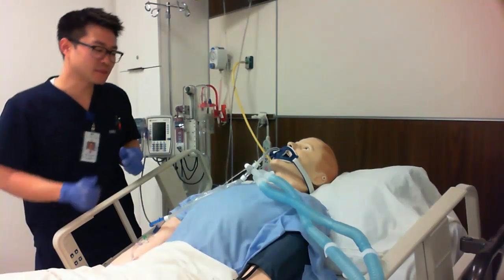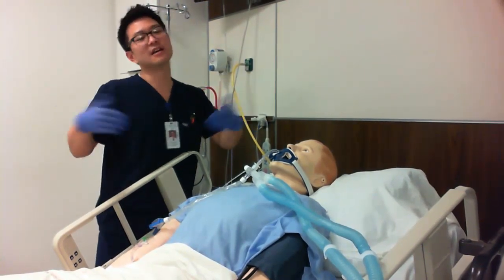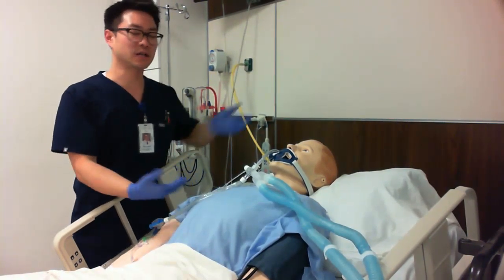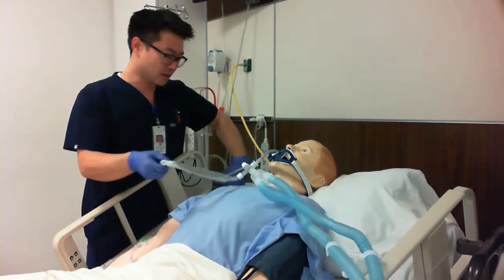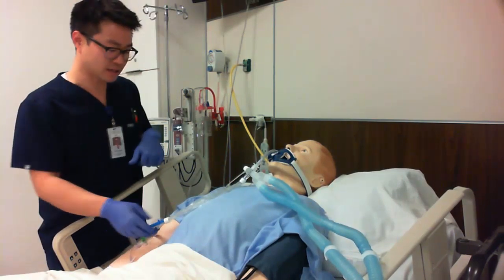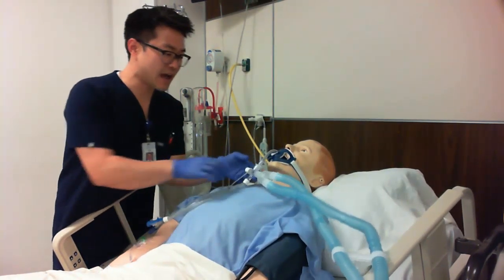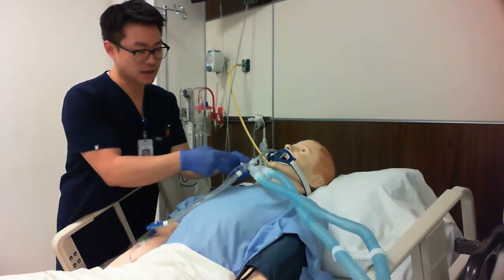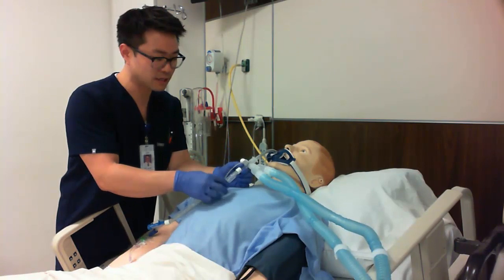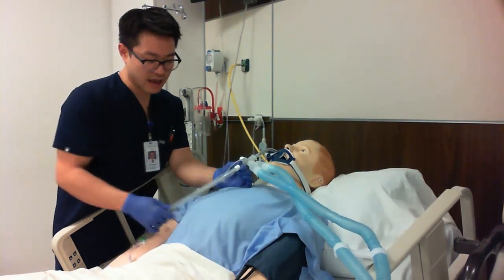Okay, so we're going to do some inline suction now. You might notice a little difference with my hands here. I've got some gloves on. Of course, while we're dealing with our patient and doing inline suctioning, we'll always want to have our gloves on. So let's start with that inline suctioning process. We are already past testing the suction. So just doing the inline suction portion, we're going to grab this T-piece that's really stable for us. Grab up here at the beginning of our inline suction catheter.